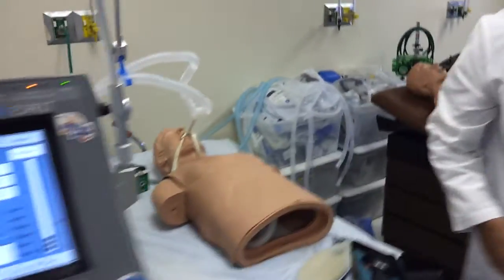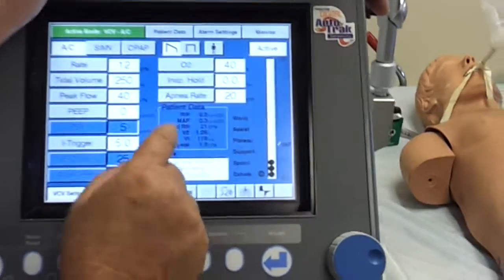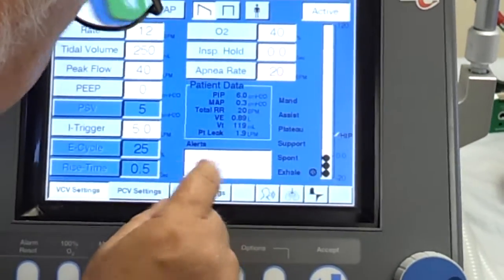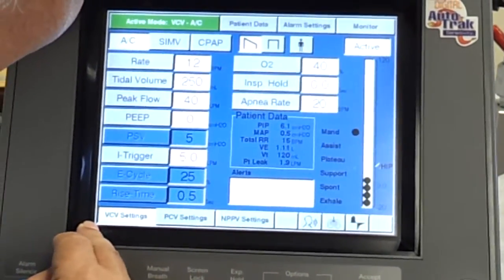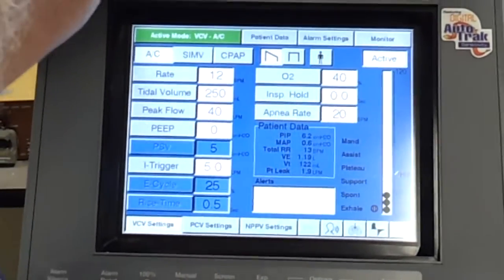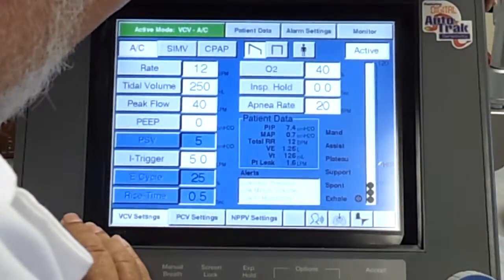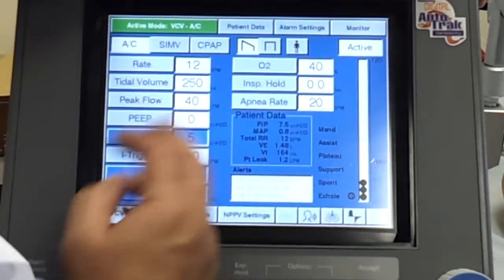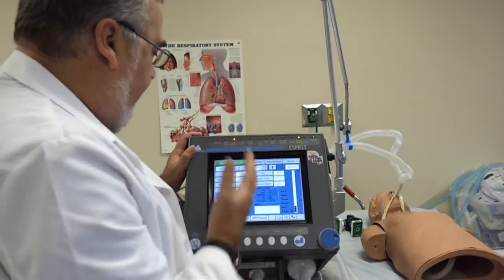He is breathing — I see his chest expanding. Then I want to check my exhaled tidal volumes to make sure I get at least 100 of what I've got set. I've got it set to give him 250. We're getting back 120. Give it a couple breaths — sometimes it goes up. It's now 150. So that's within 100, so we'll say okay. We check that he's breathing, we've got our tidal volumes where they should be. So now we can go and set our alarms.